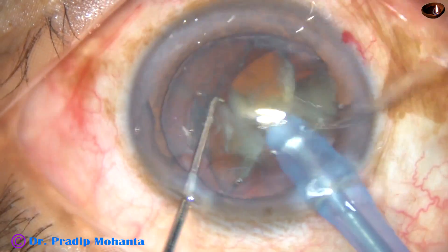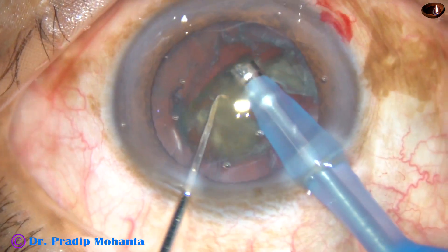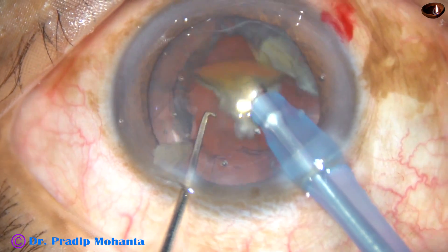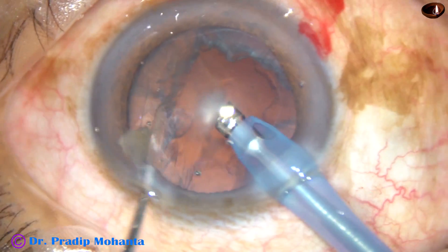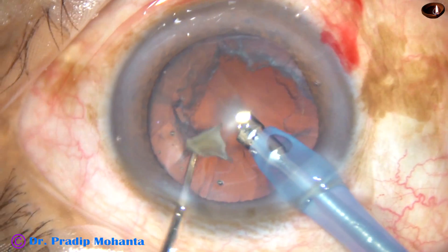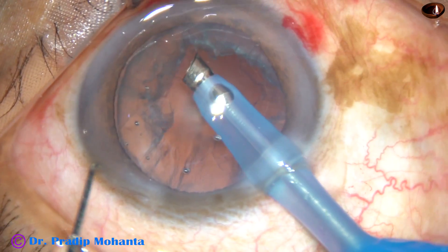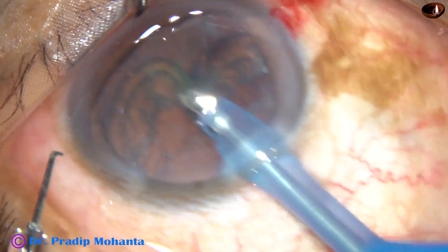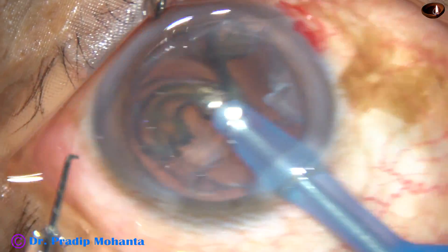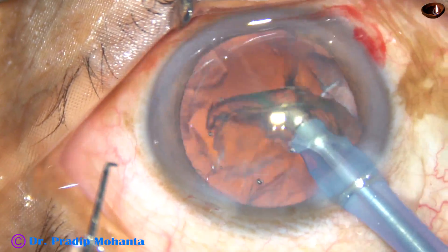Depth perception is very good. I can see the lens matter, the nuclear pieces clearly, as well as the posterior capsule very well. And now the epinucleus is mobilized and removed.